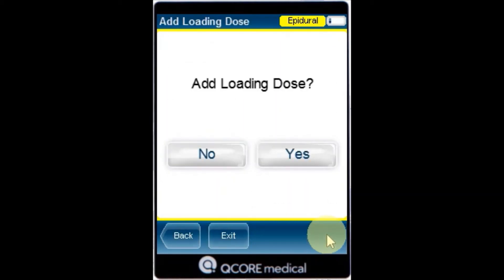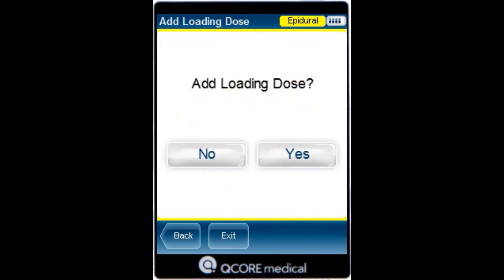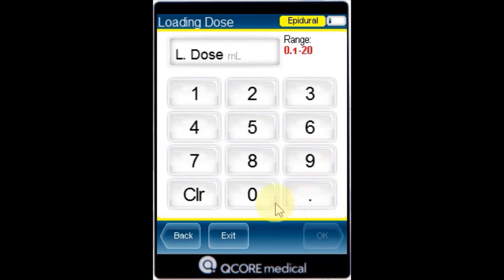The add loading dose screen then appears. Specify whether to program a loading dose. If yes, using the keypad enter the value for the loading dose and press OK. Otherwise press no.